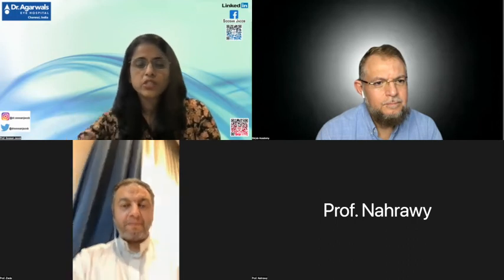And I'd also like to say that Shady Awwad from Lebanon has just also designed an instrument, which is a very, very interesting instrument for doing precisely this, where you have just a single incision and you can just pull that entire CAIRS back into the channel. So with more people doing this technique, new ideas and new instruments are going to come out, and that's exactly what I see happening.